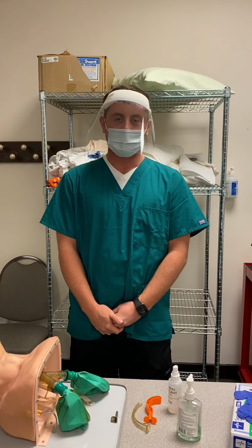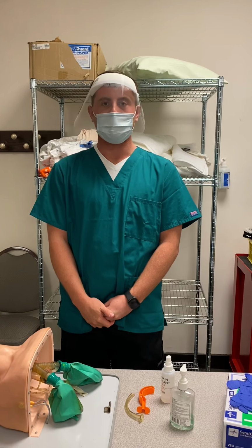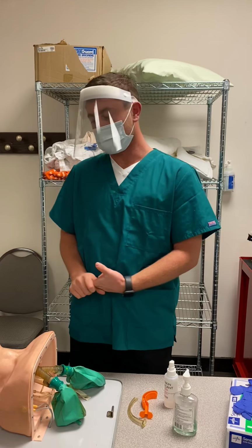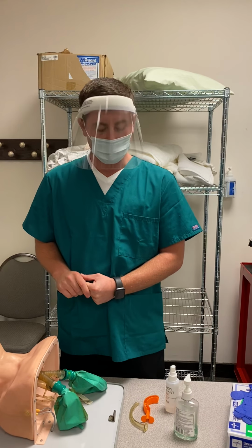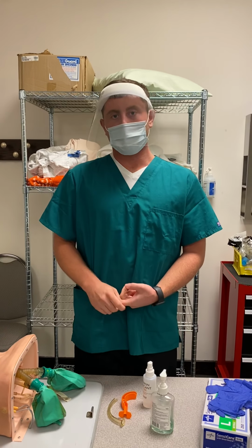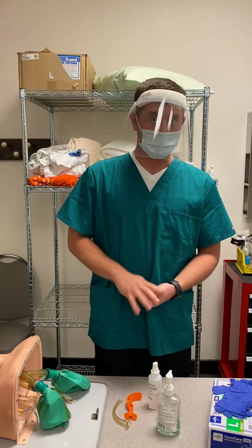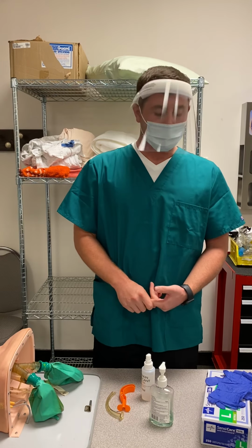This is a video for the competency test for the insertion of the oropharyngeal and the nasopharyngeal airway. First, I will review the chart to ensure that the doctor ordered the oropharyngeal airway for this patient. Next, I will gather equipment, which includes the oropharyngeal and nasopharyngeal airway, the lubricant for the nasopharyngeal airway, hand sanitizer, and disposable rubber gloves. I will follow that with performing proper hand hygiene.